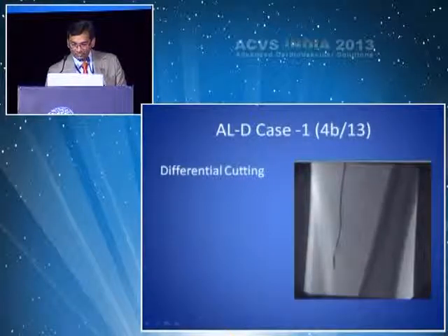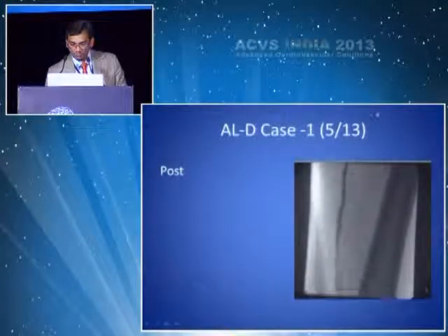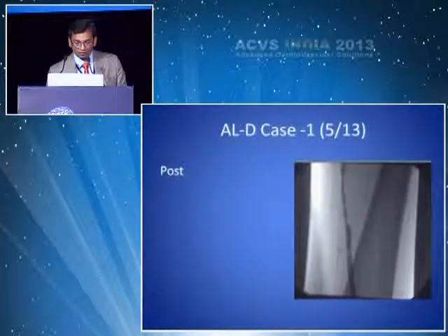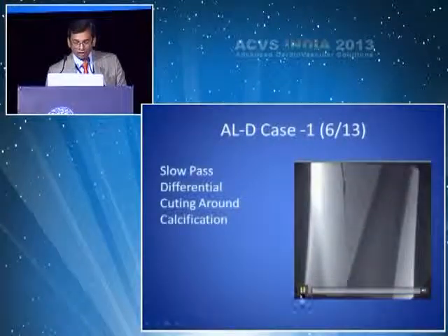There you go. This is after the multiple passes. As you can see, nice lumen establishment. You really don't need to stent these.